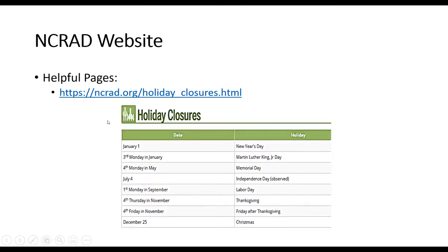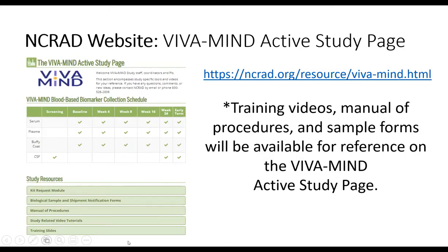On our NCRAD website, in addition to having a VIVA Mind page, there are some other helpful pages. For example, there is a page that highlights our holiday closures. There's one for what to do for Friday blood draws, but that's not as helpful for this study because all the samples are shipped frozen in batches on Monday through Wednesday. So Fridays aren't as big of an issue.